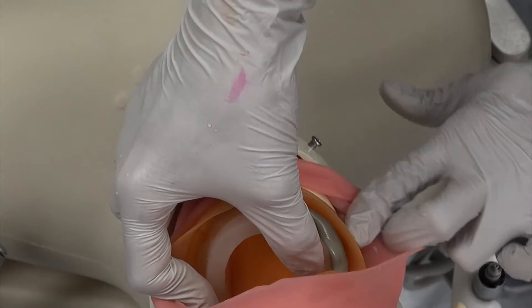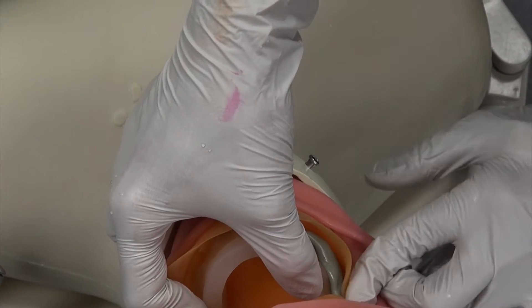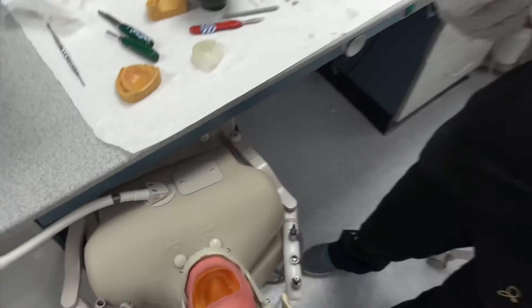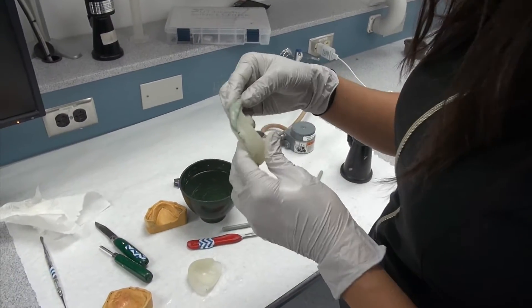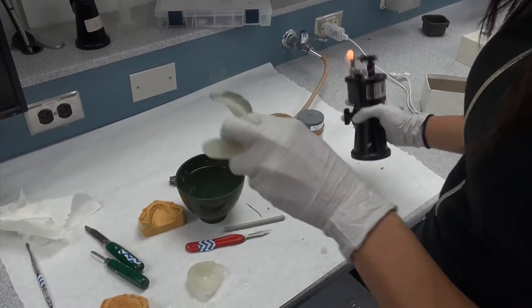Okay, you're trying to get the border, the very edge. You can see, from there, you want to take off that excess.